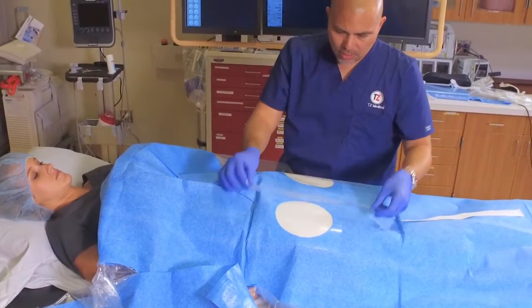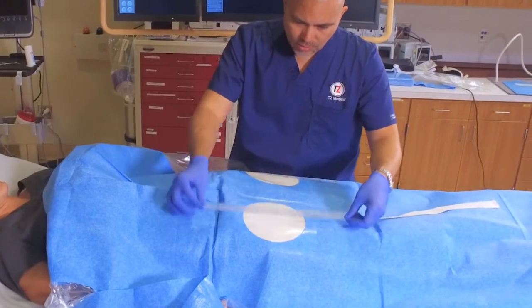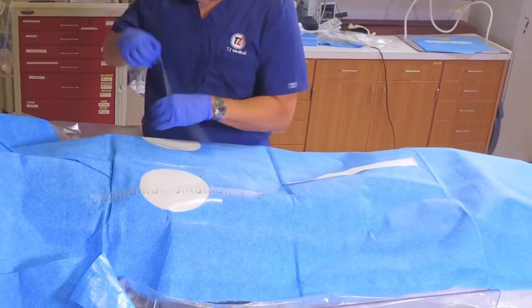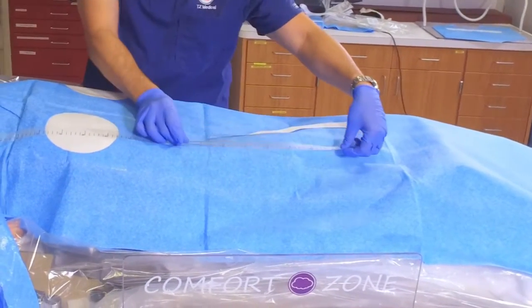During percutaneous transluminal angioplasty, the Shoot and See allows the interventionalist to accurately measure the lesion length, allowing for proper PTA balloon sizing. The Shoot and See is ideal for stent placements, in situ vein bypass, or plaque excisions.